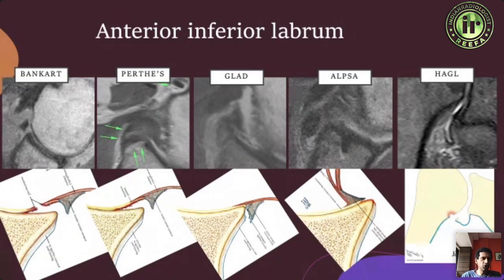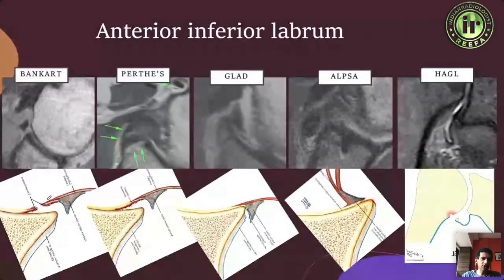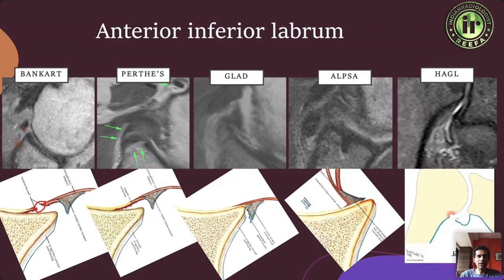Looking at MR appearances of anterior inferior glenoid lesions: the most typical is the Bankart lesion, where the labrum comes off, the periosteum comes off the bone and breaks, the capsule tears — this is your typical soft tissue Bankart lesion. If along with this labrum a piece of bone also came off, you get a bony Bankart lesion.